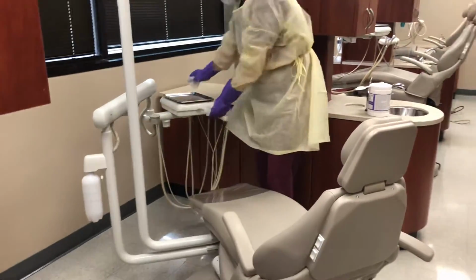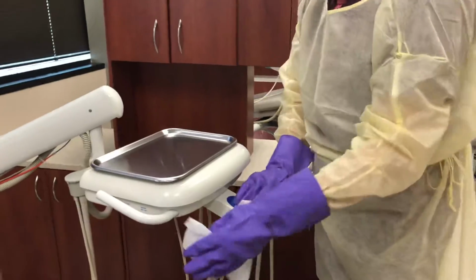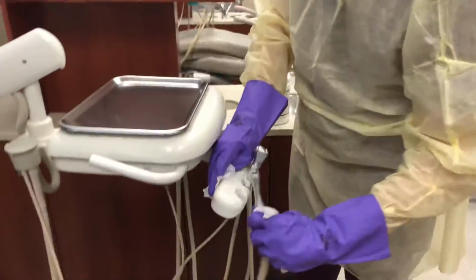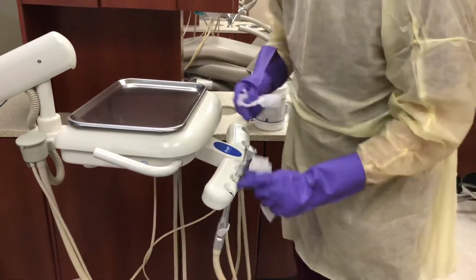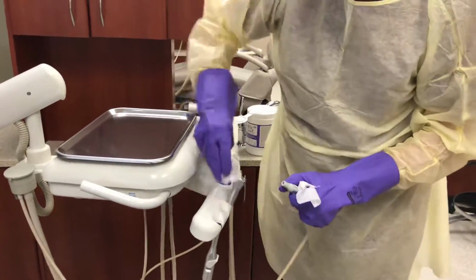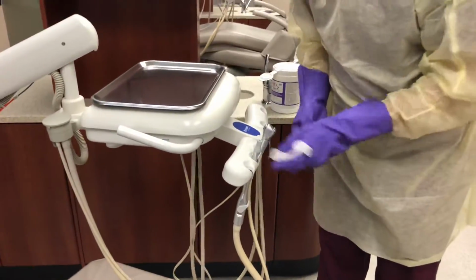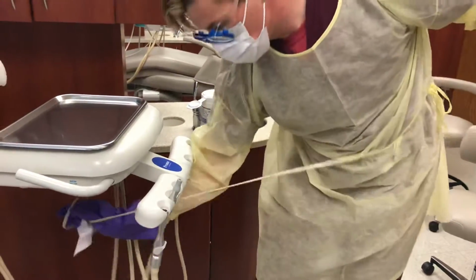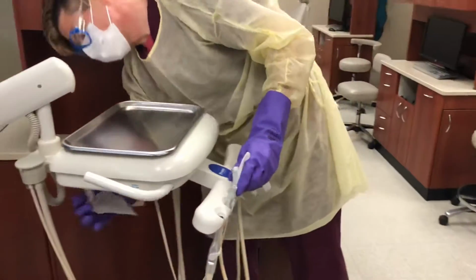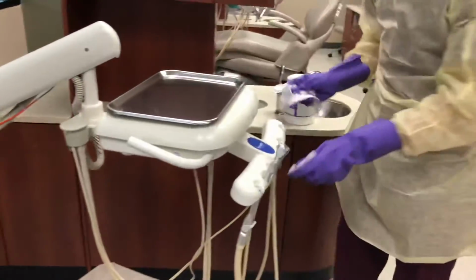Bracket tray, including arm, air, water, syringe, handpiece connectors, suction connectors, holders, and hoses. Notice how he's wiping the holder, and then he's wiping the cords, the hoses, all the way up, working his way down. You can do this in any order. You just need to make sure you're systematic so that you do not forget anything.